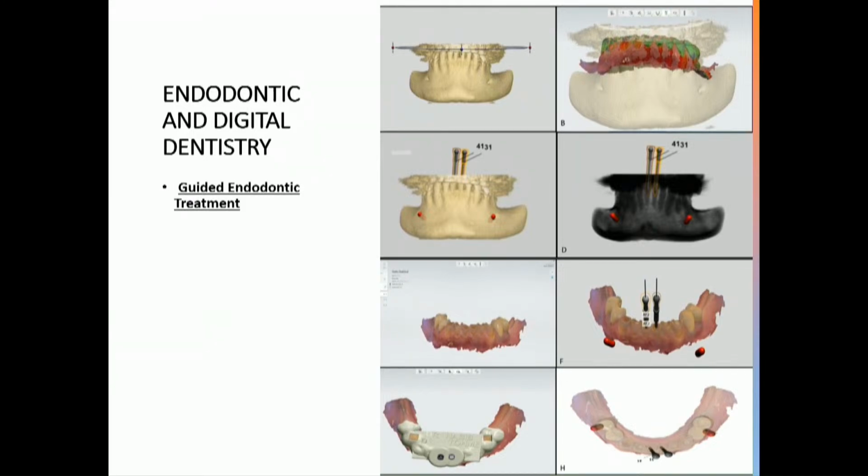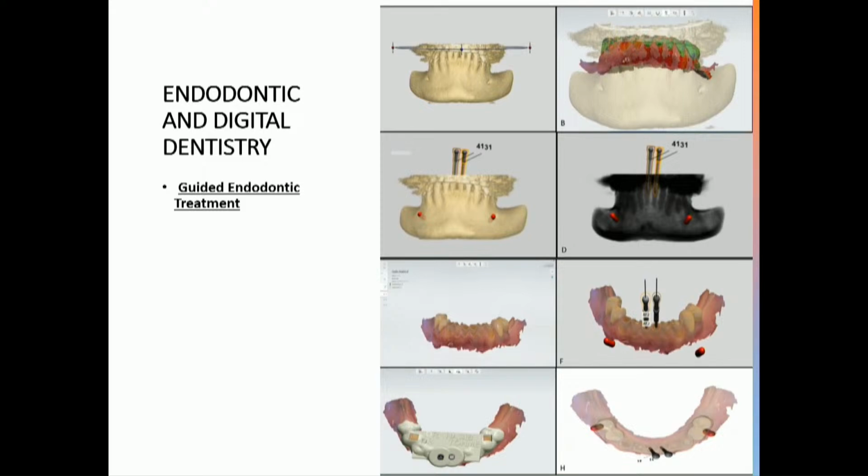You know these cases with sclerotic canals that you cannot really treat using endo? Well, yes, they're doing that now all over. And there is a guy here in Kuwait who did this, where they fabricate surgical guides, endo guides, to tell them where to drill and when to stop drilling when they're doing their endodontic treatment.